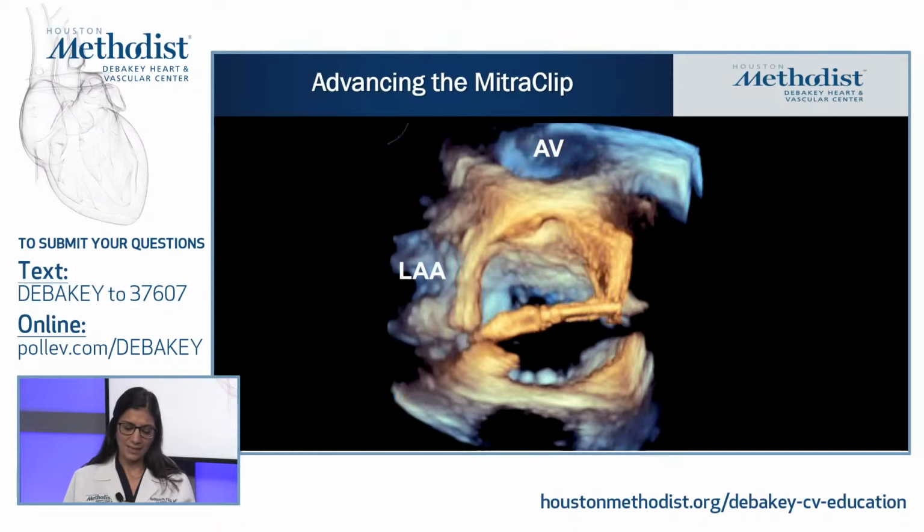And this is a 3D view of the left atrium, including the mitral valve annulus. The way we get this view is by setting up our 3D zoom box to include the left atrium close to the roof. So you want to skip the roof so you don't get an artifact, but you want to include the mitral valve annulus and you want to include the entire left atrium, so you're able to visualize these catheters and devices as they traverse the interatrial septum.